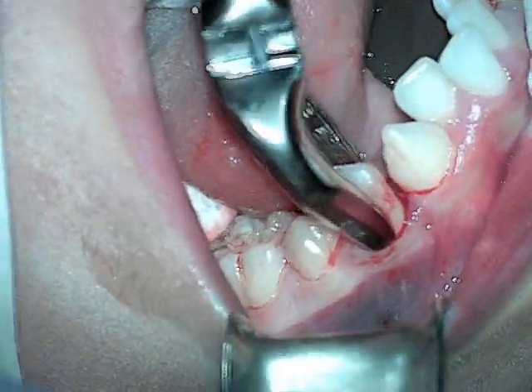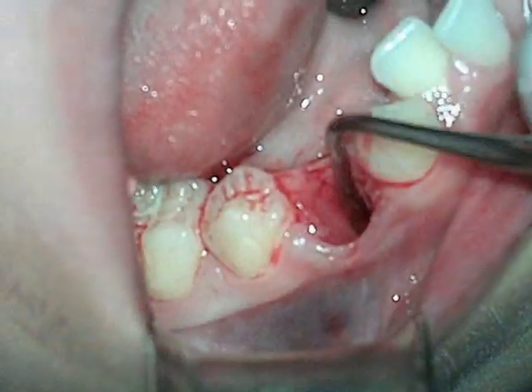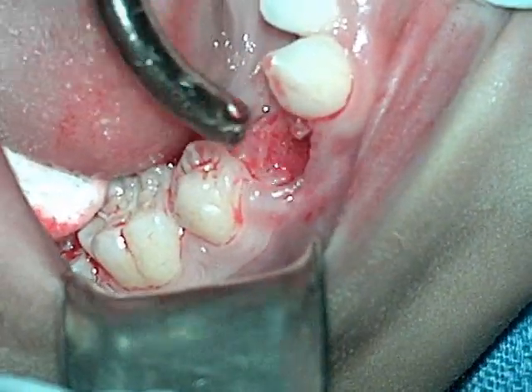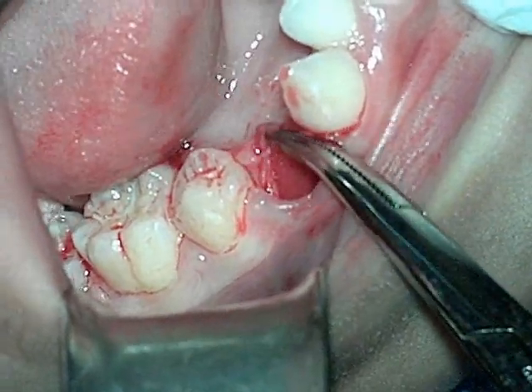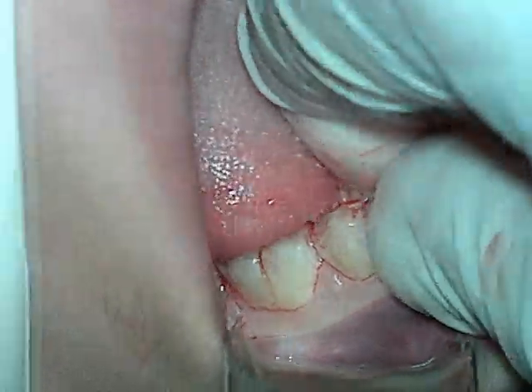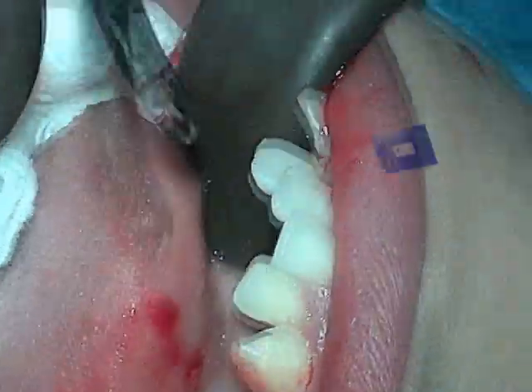And this again being a single-rooted conical root comes out quite easily. Here we see that there are actually two roots, but they're fused together. Curette out the socket, and then finally irrigate the socket when you're done after you've removed all the soft tissue debris. And then finally compress the socket with finger pressure, and that pretty much completes the procedure.